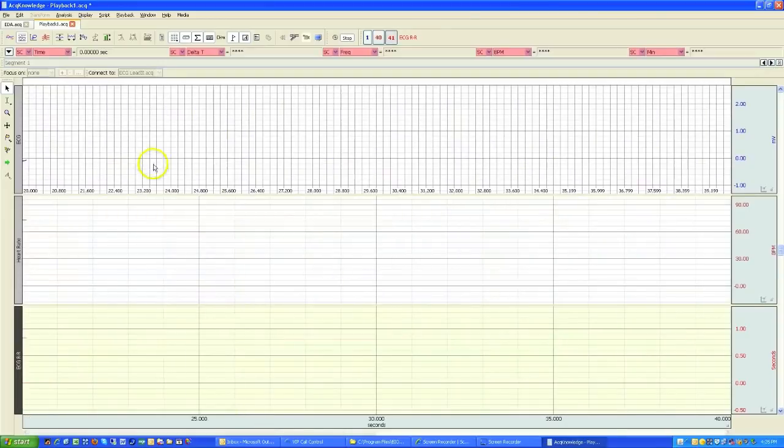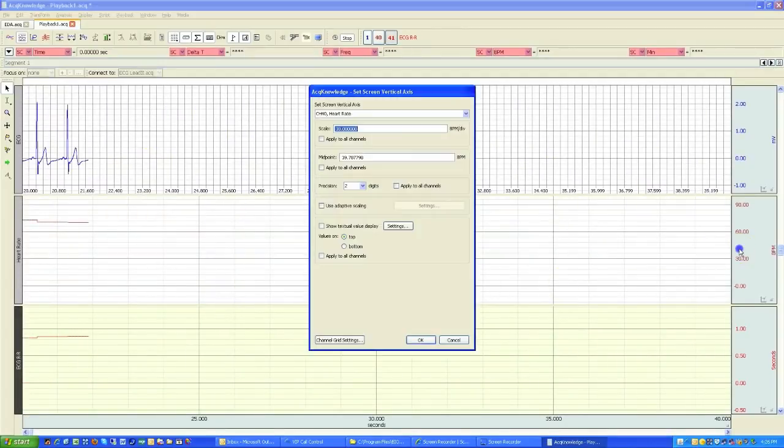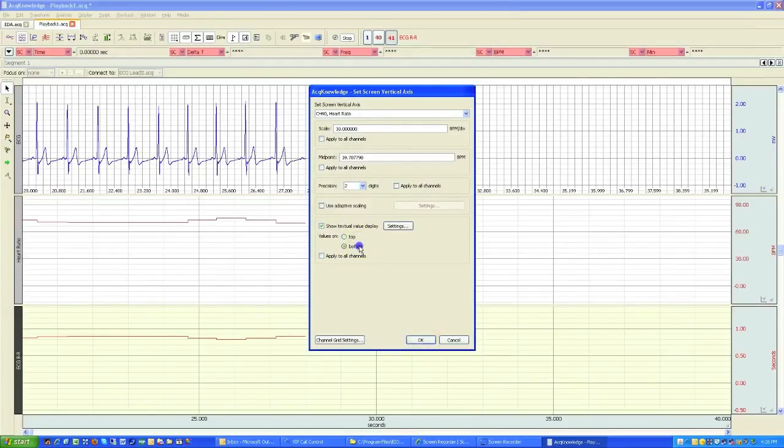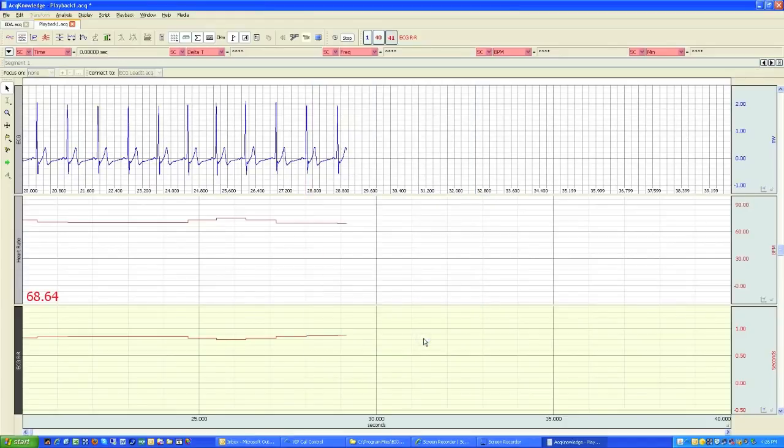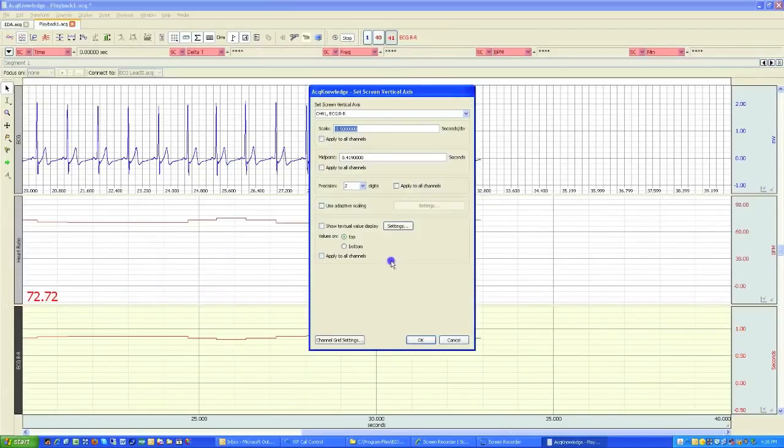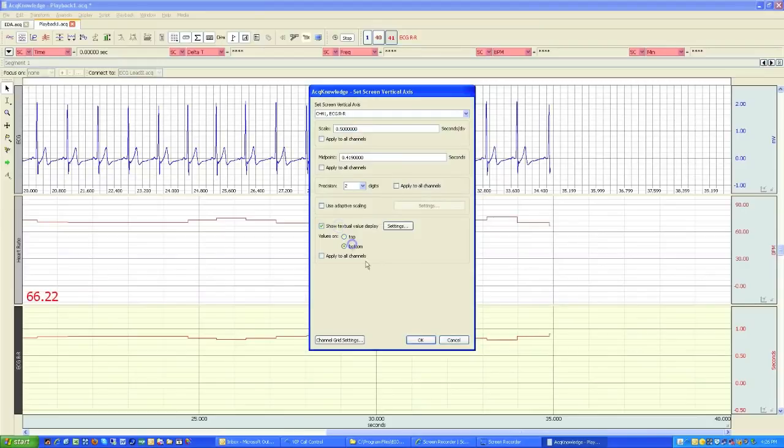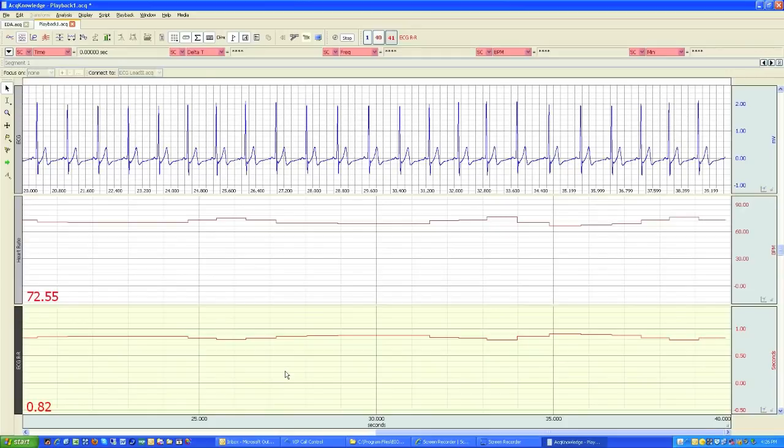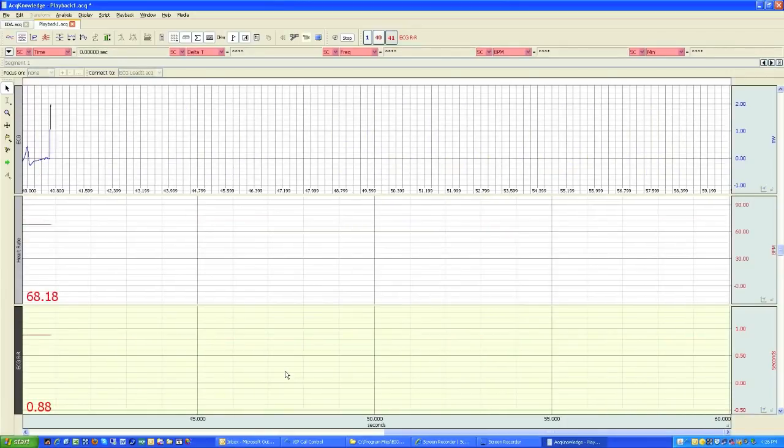The other thing we can do is come in and add the values. Show the textual values. And I'll put that at the bottom. So now we'll see our heart rate and R to R values displayed real time as we're replaying our data.